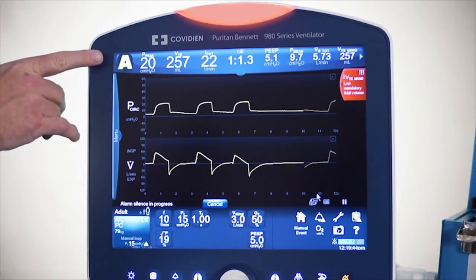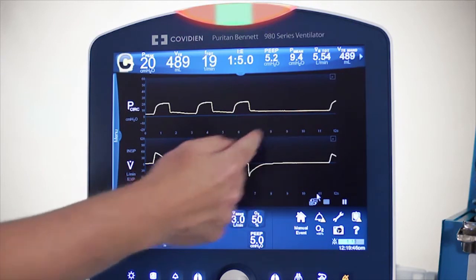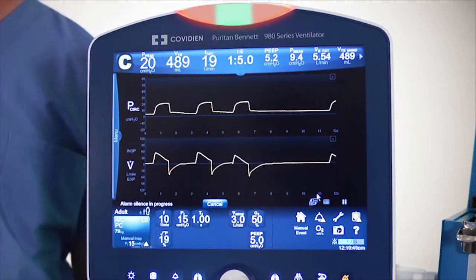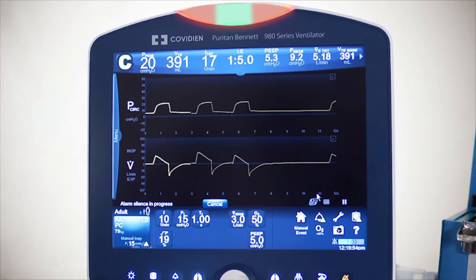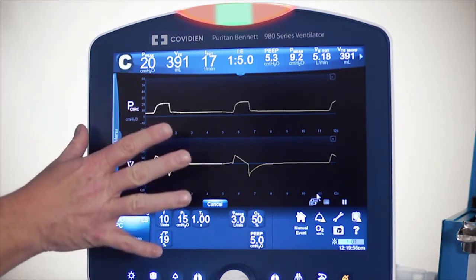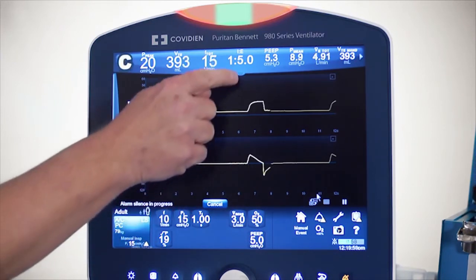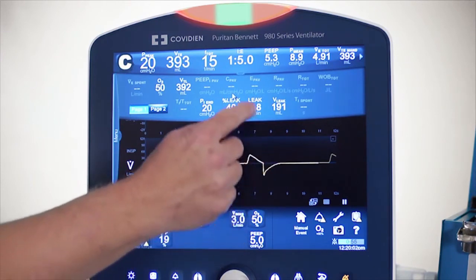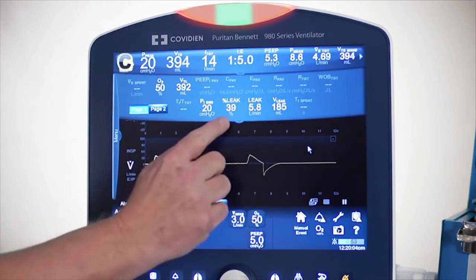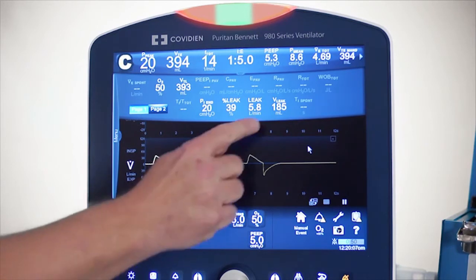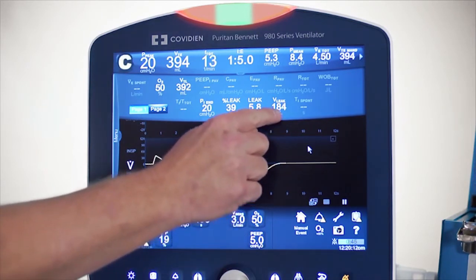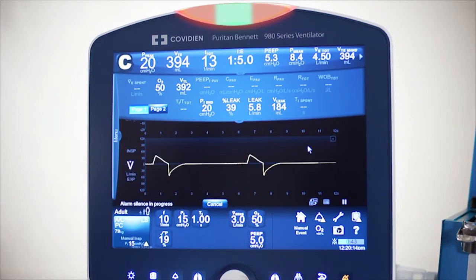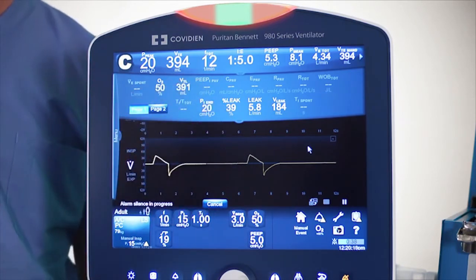You can see that the machine has stopped auto-triggering. Within about two to three breaths, it captures the leak and reduces the amount of auto-triggering. Once it's captured the leak, I can look at some displayed values. Pulling down this screen, I can see that the percent leak is 39%, the total leak is 5.8 liters per minute, and the actual leak amount per breath is 184 milliliters. Leaks can change, so I'm going to simulate a change — a pretty significant leak.